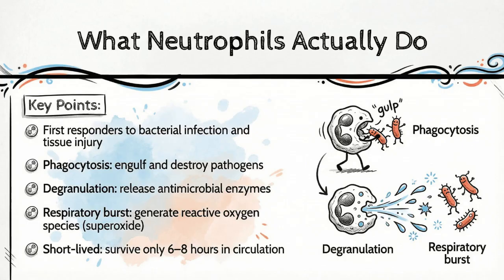This is why neutrophil granule changes are so significant. When you see toxic granulation, you're seeing evidence of an accelerated, stressed production process, where the prominent, dark granules reflect an altered synthesis of primary granules due to heightened demand during severe infection or inflammation. The neutrophil was made fast and deployed fast, and it shows. Next up, the lymphocyte, a small cell with a big role.